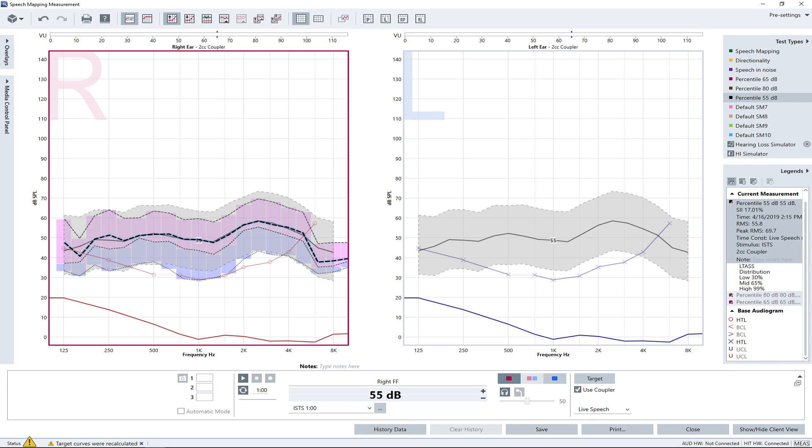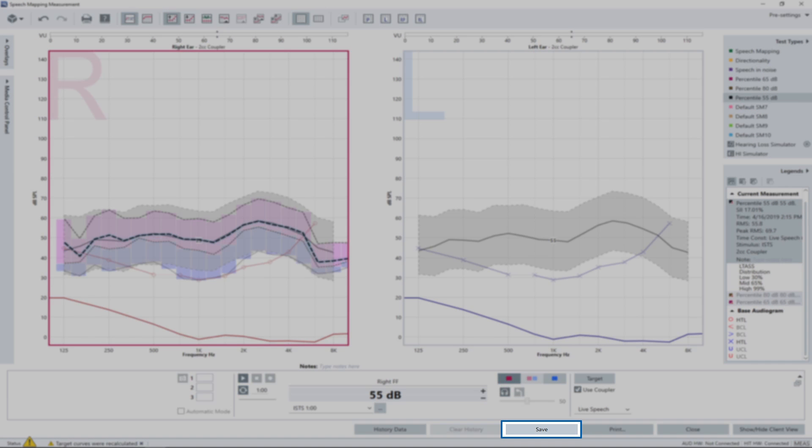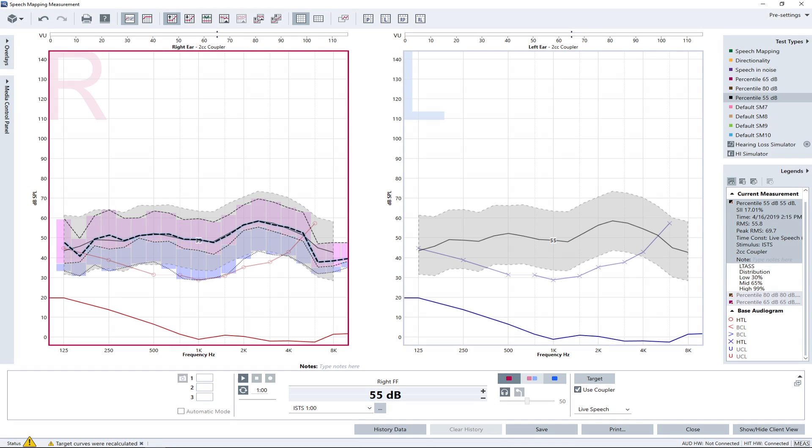After the measurements are done, click the save button and all the actions will be saved. To return to the speech mapping main page, press the close button or click on the little X in the top right corner.